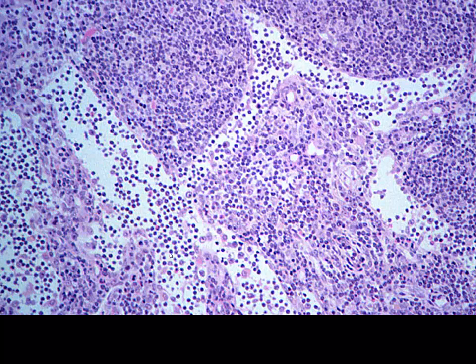Here's a higher magnification looking at our medullary sinuses. A lot of lymphocytes here, the smallest of the cells. We have our larger granulocytes, macrophages, antigen-presenting cells also swimming through here. But notice we don't have red blood cells. So that's going to be a tip-off. Even at this high magnification, we're looking at a lymphoid sinus. And here one of our cords. And since we're talking about the lymph node, this is going to be medullary cord and medullary sinus.